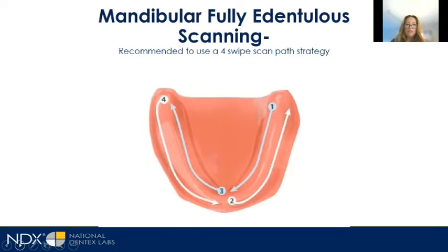And if you have an edentulous case where you did an immediate denture and it has healed and you have a chairside reline that fits really great, you love the suction, you can also scan that. I find that if you're using a wash, if you use more blue or green light and heavy body, it scans easier.